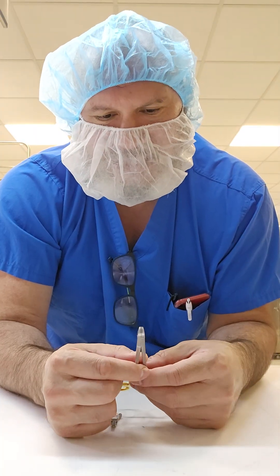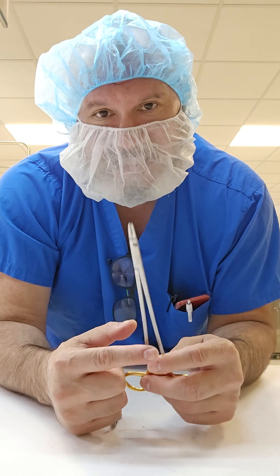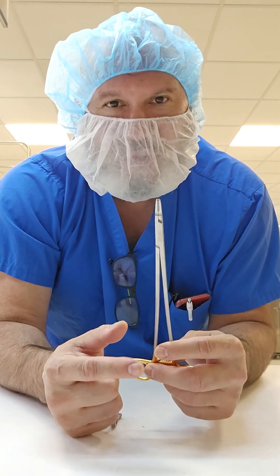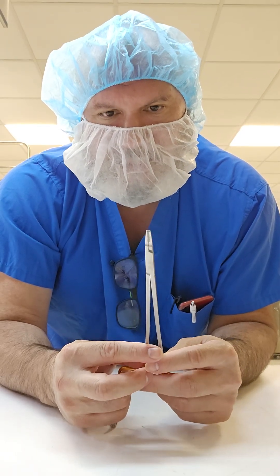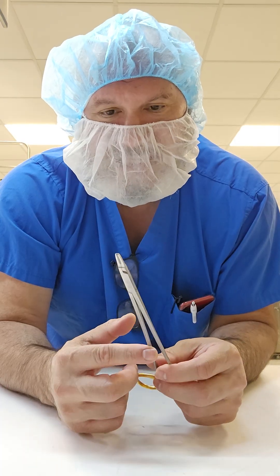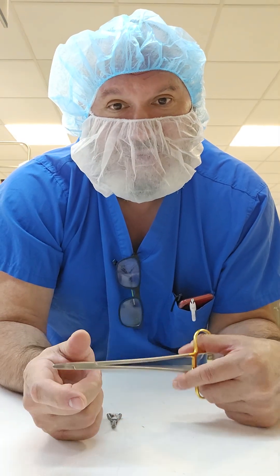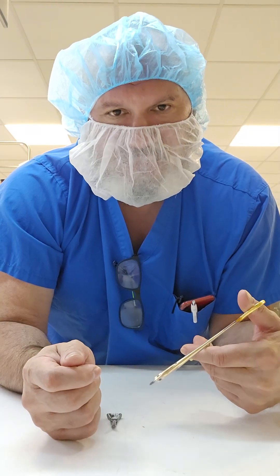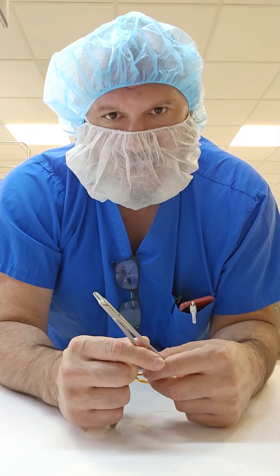Now why would we demagnetize instruments? Well, needle drivers, for one — if they're magnetized in plastic surgery, cardiac surgery, or any surgery — can wreak havoc and disruption within the department. The suture will stick or magnetize onto the instrument, making it hard to manipulate or to release during the actual procedure, and that can cause some delays or issues.